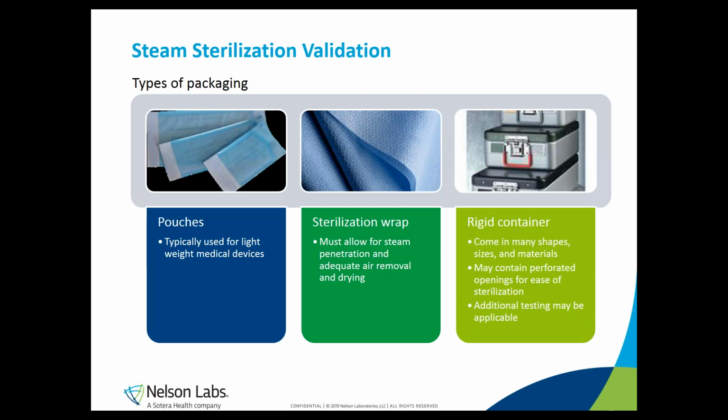After inoculation, the product is actually ready to get packaged. There are different types of packaging, but not only the type of packaging, but also the size of the packaging is important. We do not want a packaging that is too tight, because then there is a higher risk for ruptures. First of all, we have the pouches.